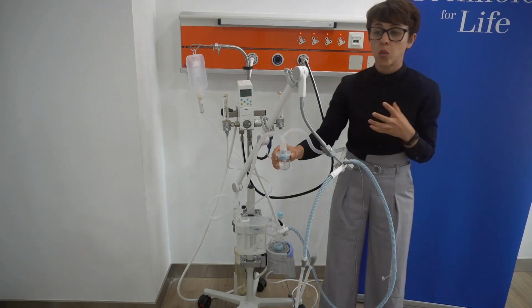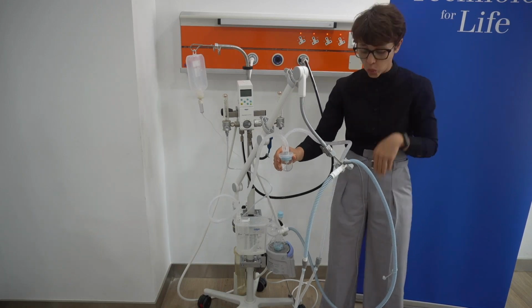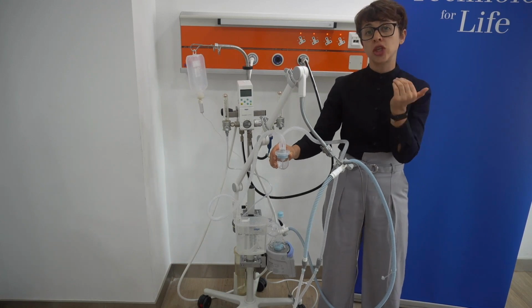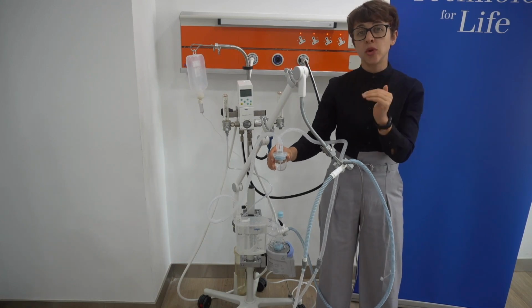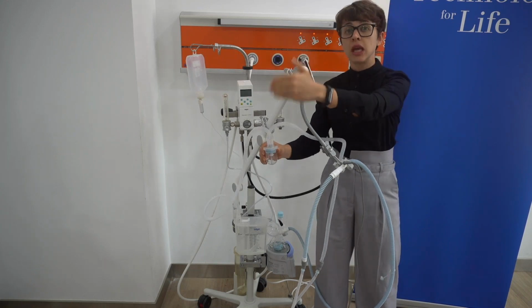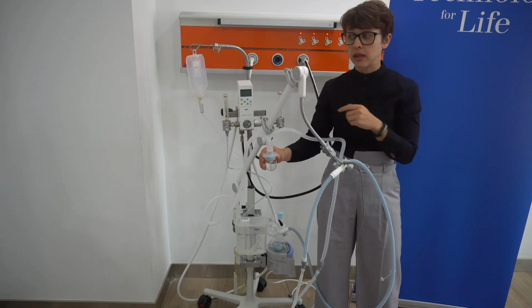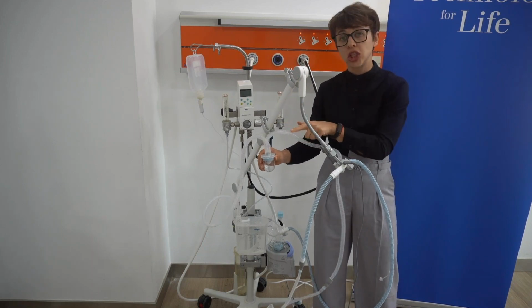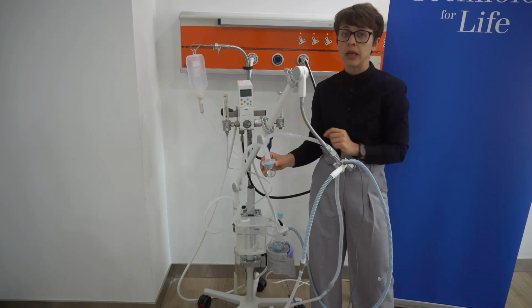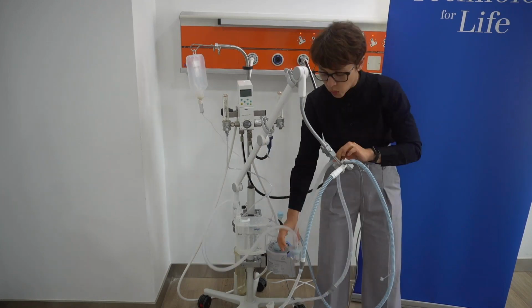Because what we're going to experience is that we have warmed and humidified air delivered to the patient, and when the patient exhales, the temperature difference between the exhaled air and the outside temperature will have a condensation effect in the expiratory limb. That's why it's very important to have the water trap, which is properly positioned.